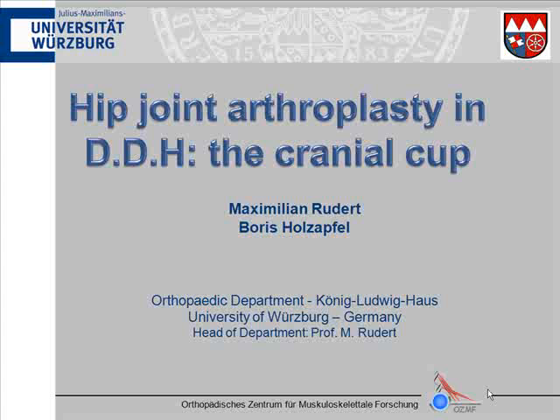And I want to talk about CDH or DDH, developmental dysplasia of the hip, and I want to talk to you about a special cup replacement that we are doing in our city. If we use this classification of arthroplasty, you know that you have a shallow acetabulum, or you have a high-riding femur which has a new contact at a new acetabulum area, or you have a real dislocation of the hip. But you all know that.